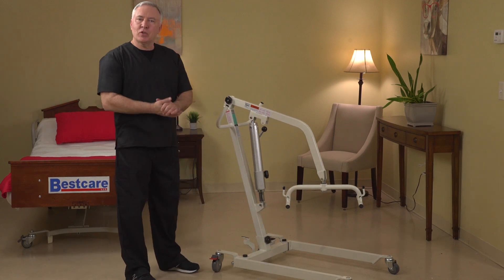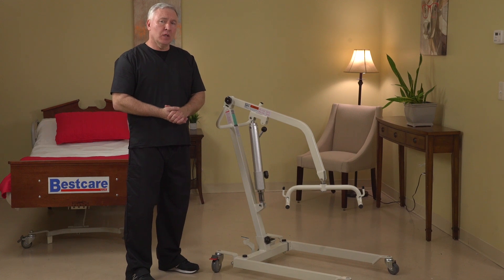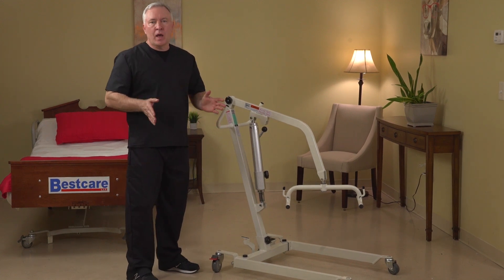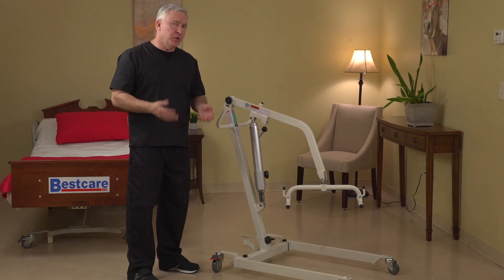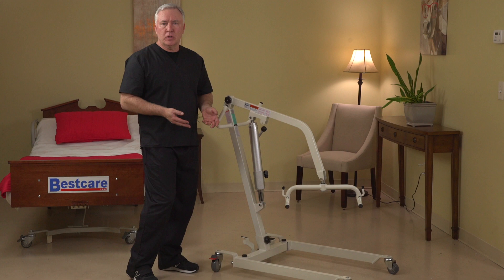Hey everybody, this is Damian with Best Care here to talk about our PL400H Specialty Lift. The PL400H is one of our products that's been in the line for quite a long time. It used to be called the Genesis Patient Lift, and now it's called the PL400H and it's a specialty lift.